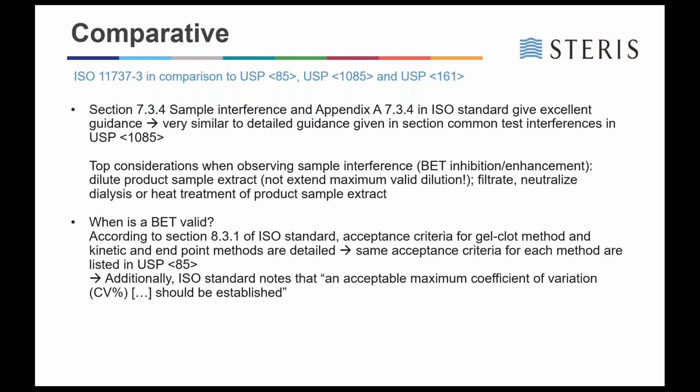Another aspect with respect to standard requirements is of course to answer the question, when is a bacterial endotoxins test actually valid? And according to the ISO standard, the acceptance criteria for the gel clot method and also for the other methods, so for the kinetic and endpoint methods, are detailed, and those are the same acceptance criteria as we find for these tests in the USP.